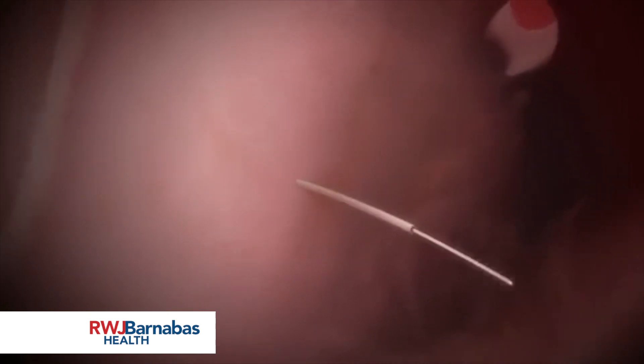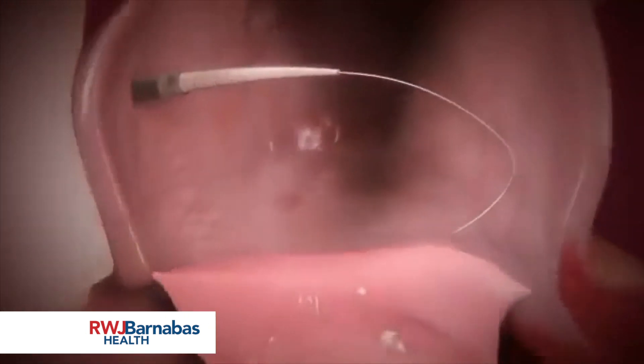MitraClip's steerable guide catheter is introduced over a previously placed guide wire. The dilator is used to gradually advance the guide into the left atrium, and the guide wire and dilator are then removed.